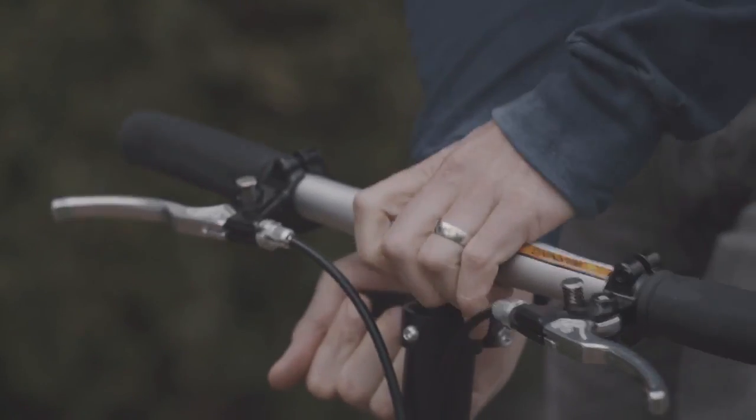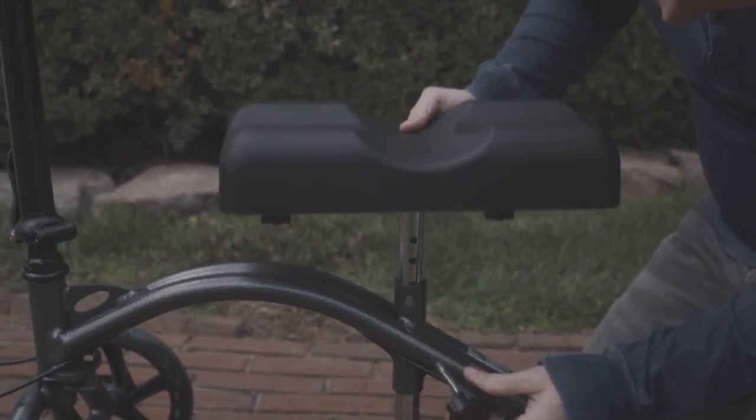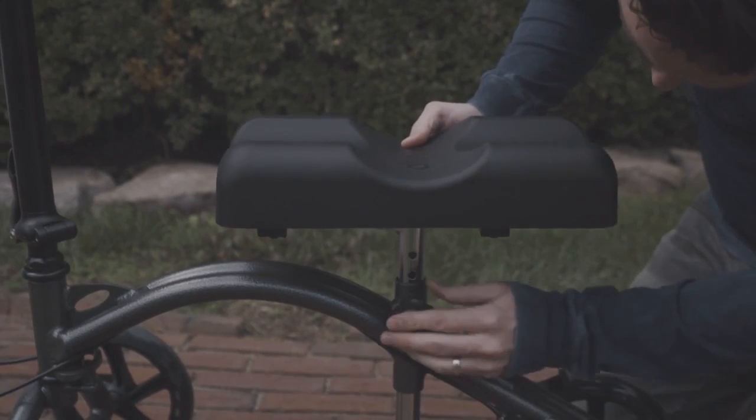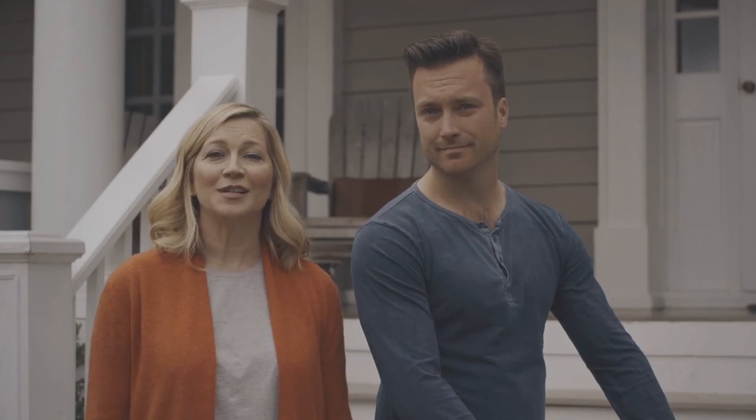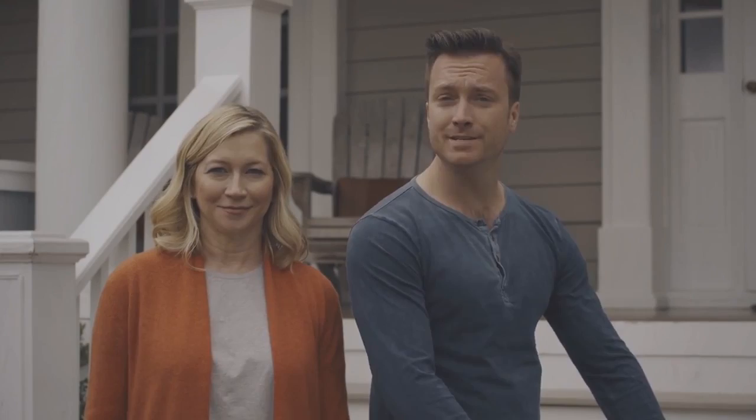Rich, don't forget that it's height adjustable. With the push of a button, Rich found the perfect height. The Drive Knee Walker has been the perfect solution for us. Thank you, Drive, for paving an easy road to recovery.